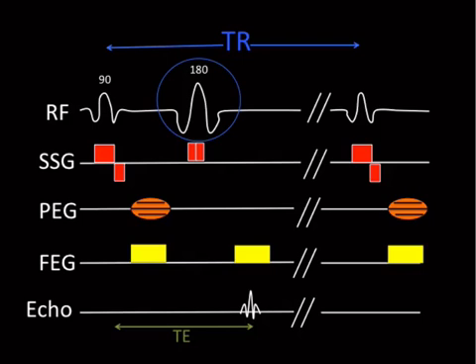The pulse is given to try and improve the heterogeneous nature of the field. And that's the reason that spin echo gives us a T2 instead of a T2 star. And that's a testable point as well. Spin echo, you're looking at a true T2, or supposedly, or you're trying to anyway.